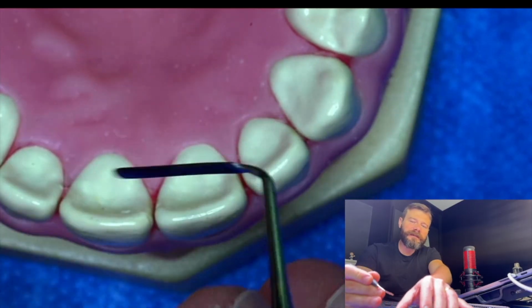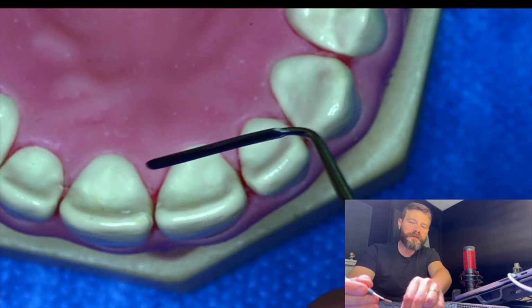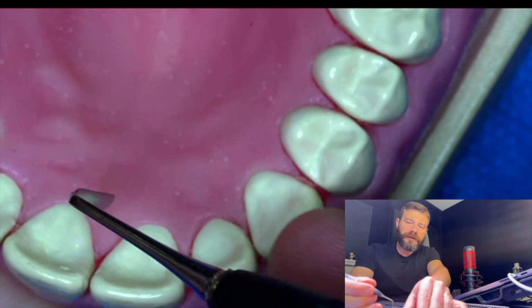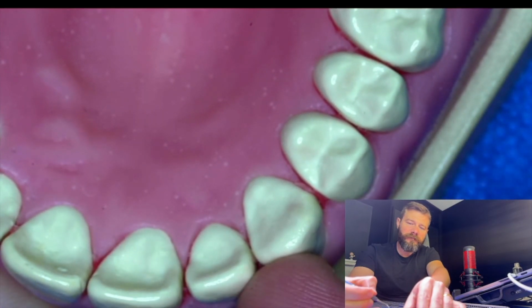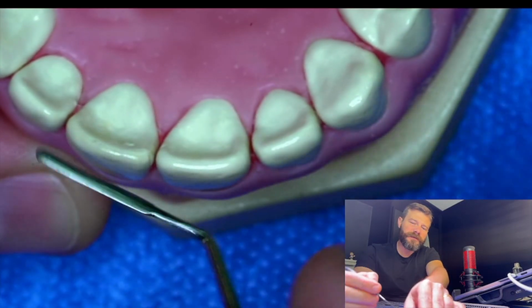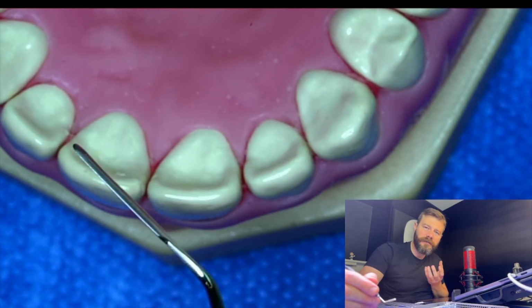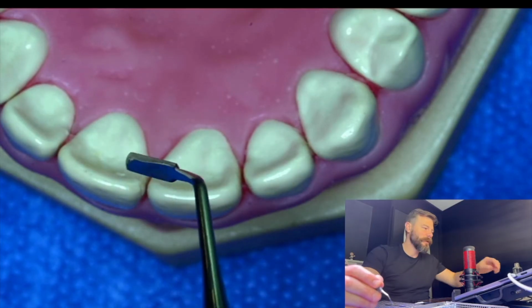This instrument that is super sharp on the tipping point, almost like a blade, allows me to detach the sulcus in a very atraumatic way, and it has different curvatures so I can do this job. When I'm going to do an atraumatic extraction, you can use an instrument like this one. So I need to do an atraumatic extraction going along the sulcus on the lingual side, palatal side. This instrument can really deliver the job. That is one of the works this instrument can do.